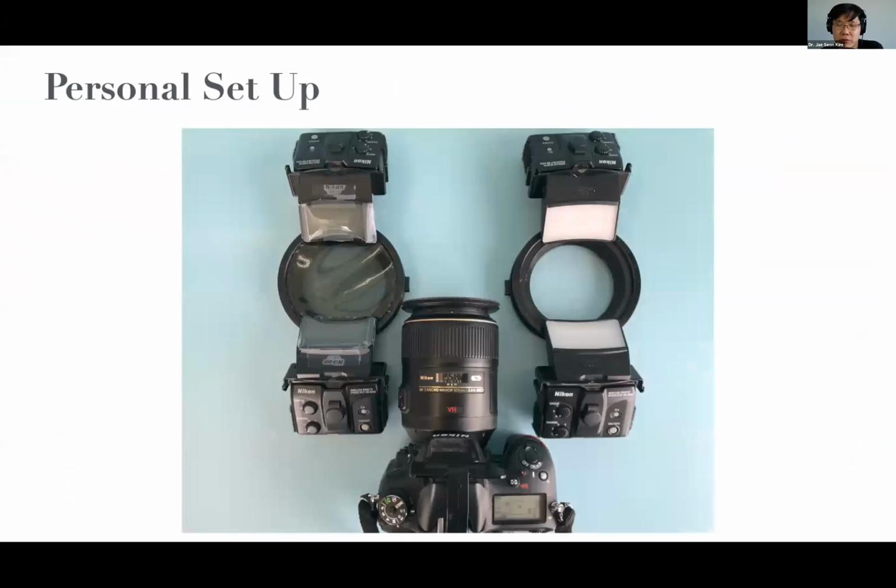Now, we've talked about how to set up your camera, and this is where the rubber meets the road. So how do I set up my camera? Because there are so many different brackets and systems that you can use, and flash systems, ring flashes, twin flashes. This is basically what I use in my daily practice. This is what I carry into the operatories all the time.